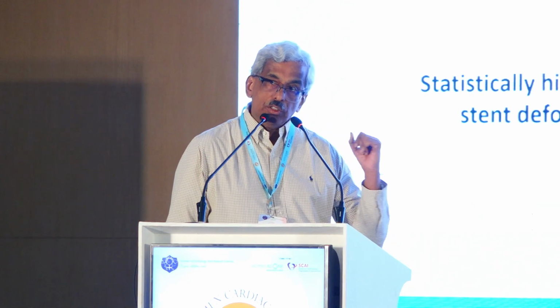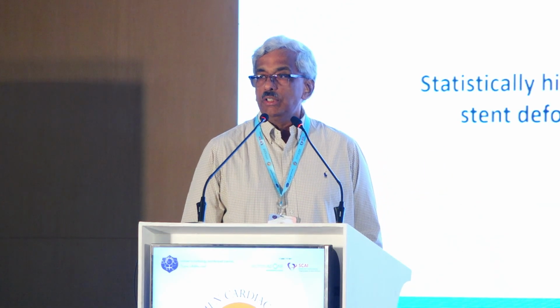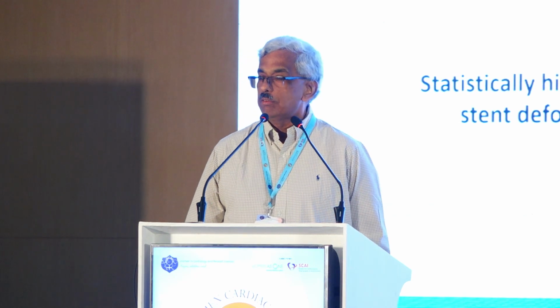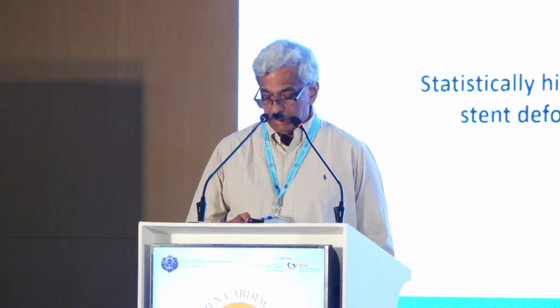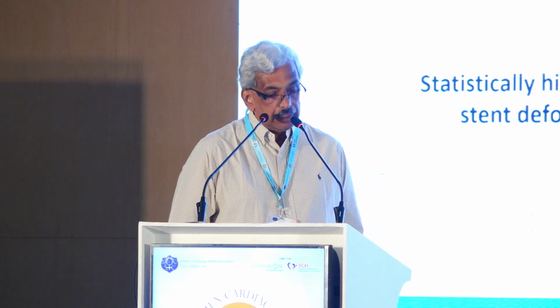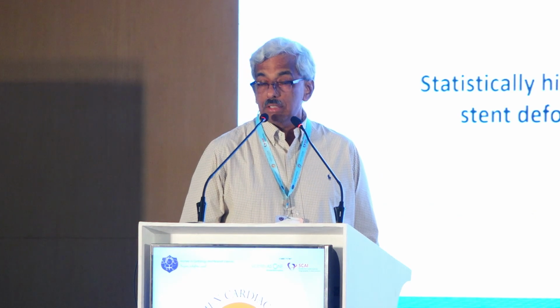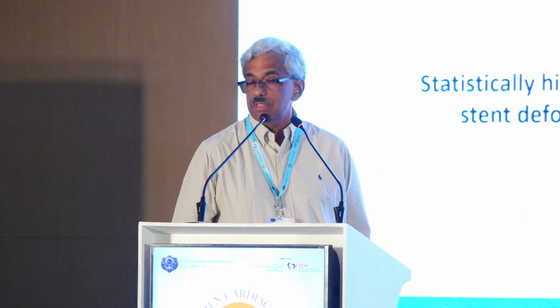And when you are trying to push the stent up or push the stent in, and you deform the proximal part of the stent with longitudinal stent deformation. So these are the three areas where you need to be careful when you're doing left main stenting. So clearly we need to not have a stent deformation from the EXCEL data. You will get double bad outcomes in terms of MACE.